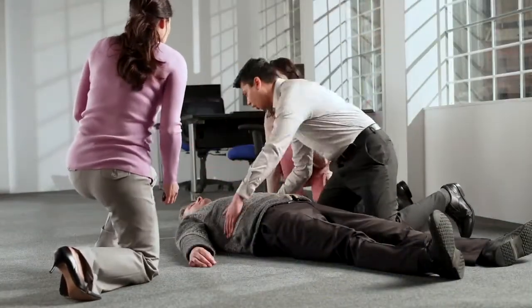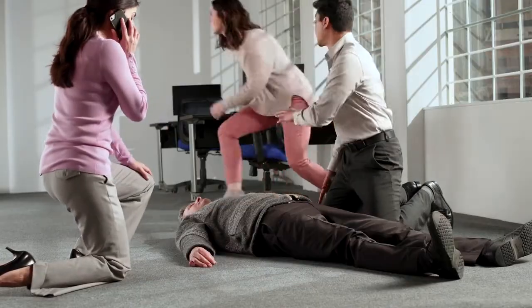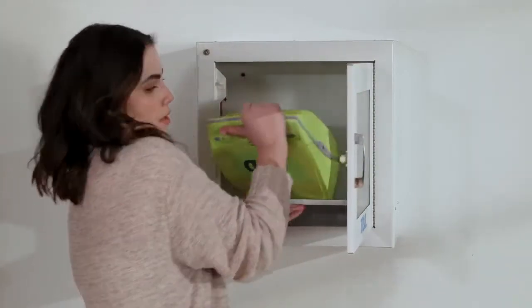Michael, are you okay? Are you okay? You, call emergency services. You get the AED. Hurry. I'm going to start CPR. Call emergency services, have someone retrieve the AED, and begin CPR immediately.